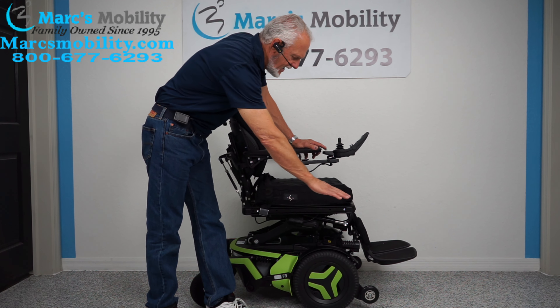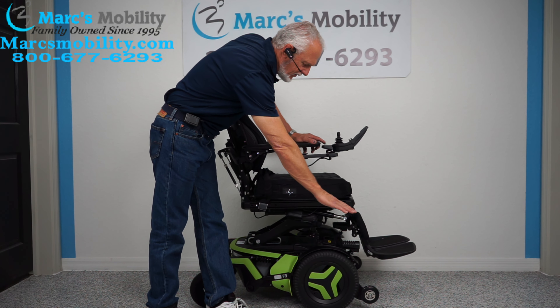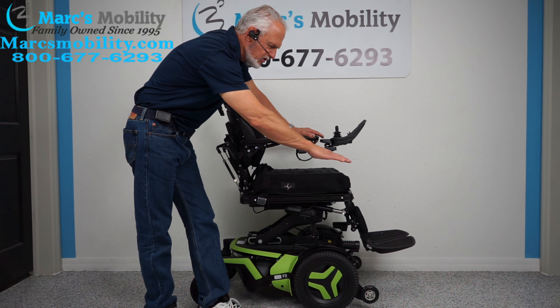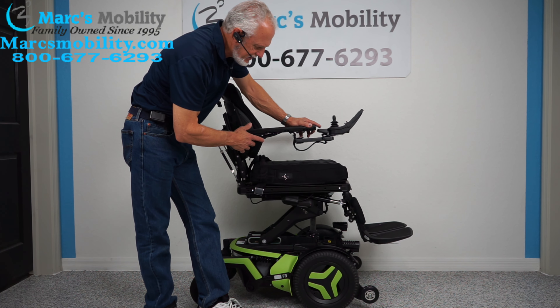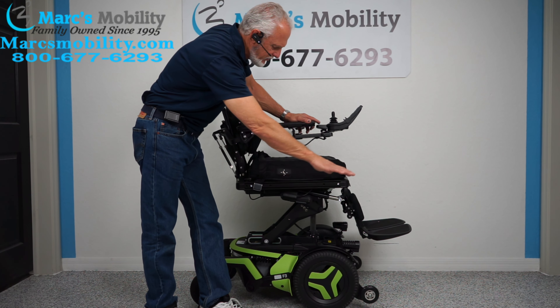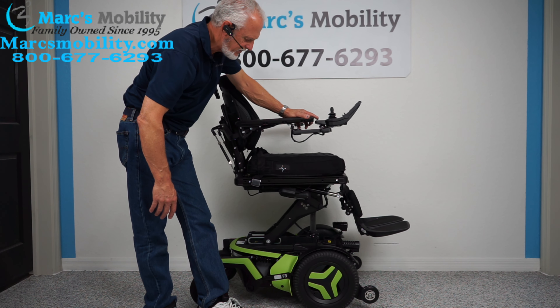You're going to start roughly at 22 inches when you're down, and if you add 12 inches, you'll be at 34 inches by the time it's all the way up. The nice thing about these chairs is when you're all the way up, you can still drive the chair at a decent speed.